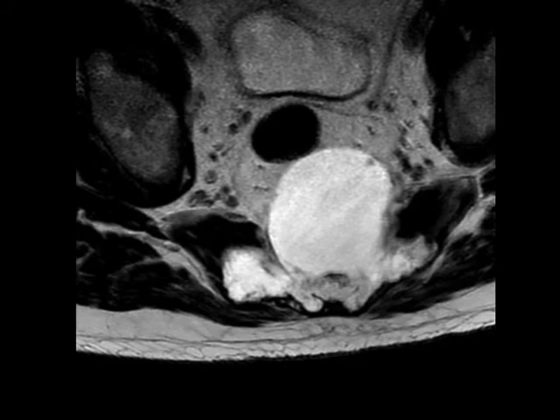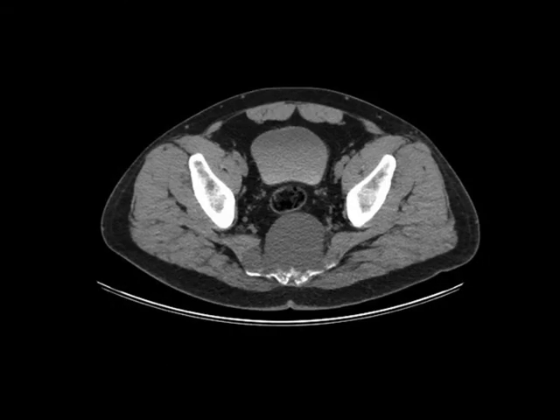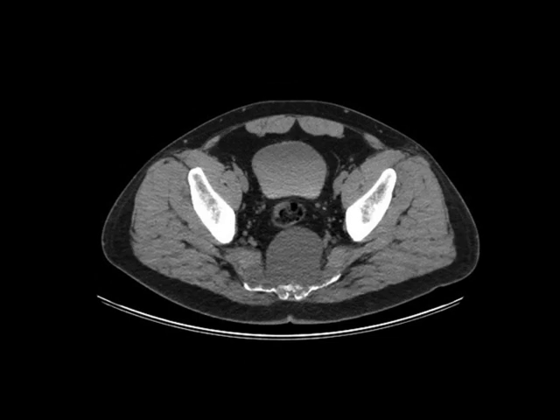This is a great example of a chordoma arising from the sacrum. In terms of my differential diagnosis, I'd consider other entities including things like a chondrosarcoma, maybe a plasmacytoma, maybe a large metastasis, myeloma, or even some kind of a giant cell tumor. In this case, this turned out to be a sacral chordoma, and you should be able to arrive at that diagnosis at the top of your differential based on its T2 signal characteristics.